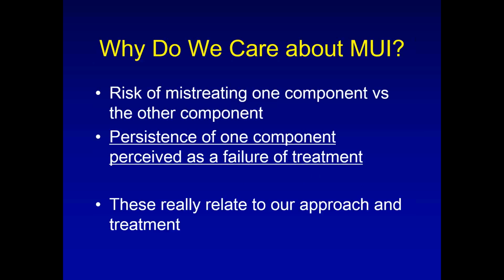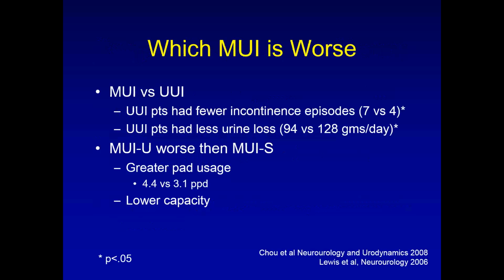The other examples are fine too. I've had patients with urge incontinence and stress incontinence. They want to get treated for the urge. They don't get better with medications. And then the question is, should you be pursuing a more aggressive urge incontinence pathway? Like the next step would be Botox or InterStim. Or should you assess to see if they have more of a stress incontinence picture? Maybe that's why they're not getting better. It's not that the urge treatment didn't work. It's that the stress component is now the predominant problem, and you might see that on your urodynamic study.